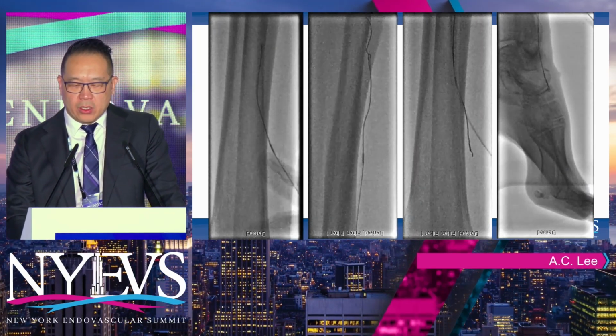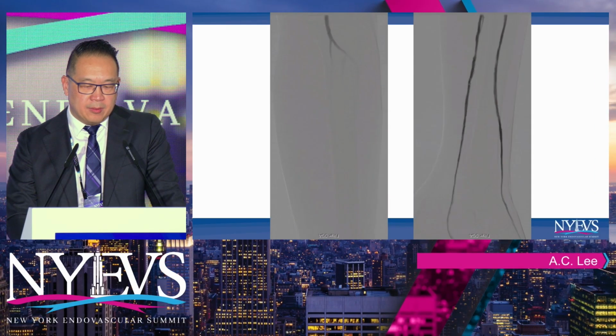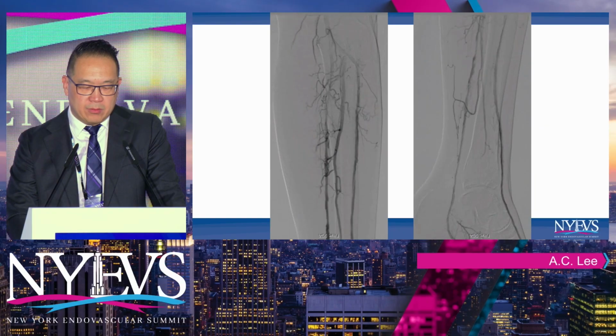This one reconstituted in the arcuate, so we got down to the arcuate artery, into the open artery, and then we gave her 3-vessel runoff.